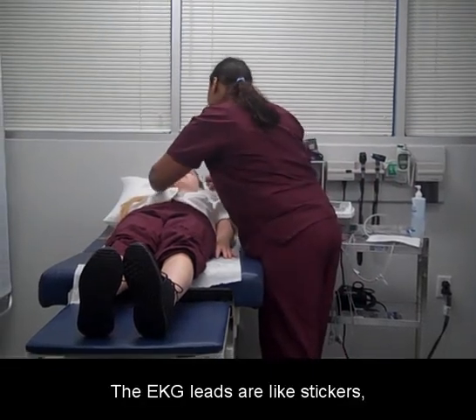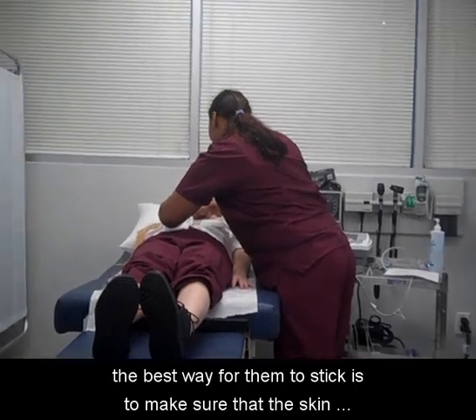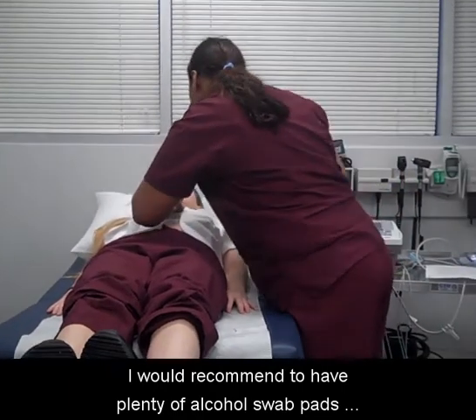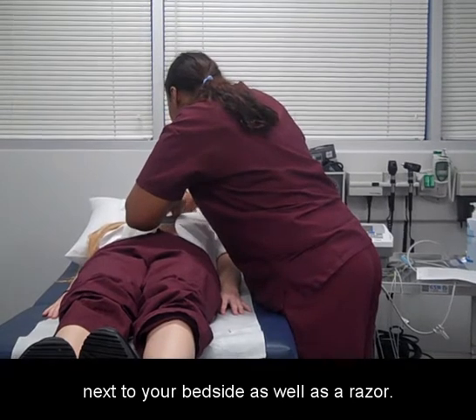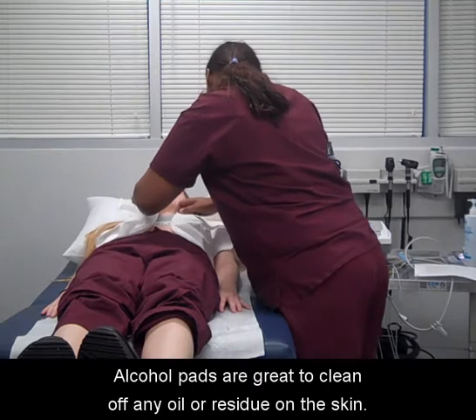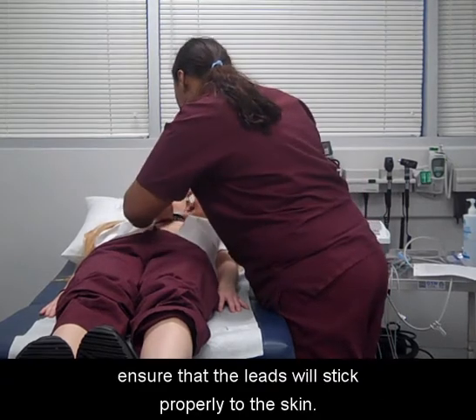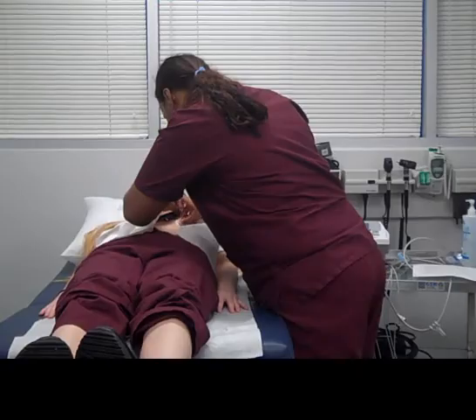The EKG leads are like stickers. The best way for them to stick is to make sure that the skin is dry and clean. I would recommend to have plenty of alcohol swab pads next to your bedside, as well as a razor. The alcohol pads are great to clean off any oil or residue on the skin, and the razor blades are great to shave any hair to ensure that the leads will stick properly to the skin.